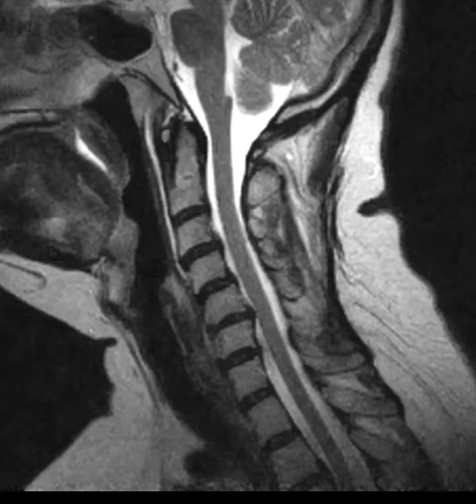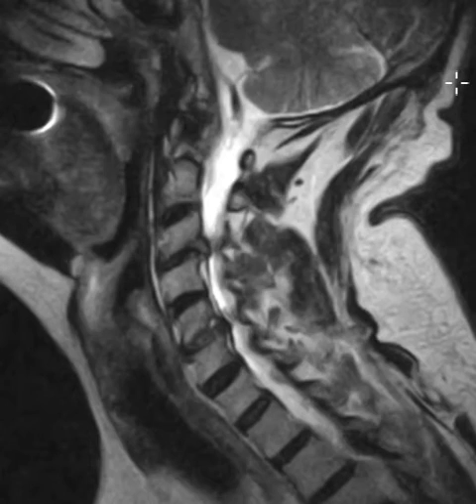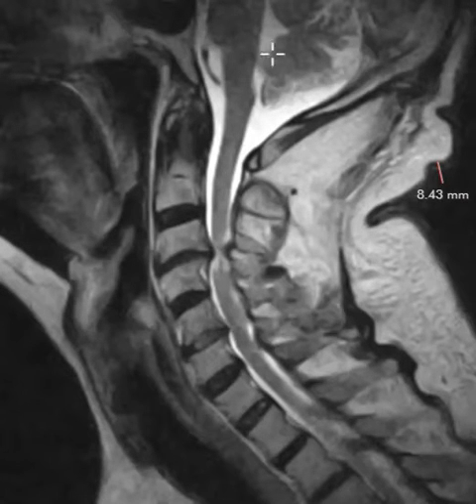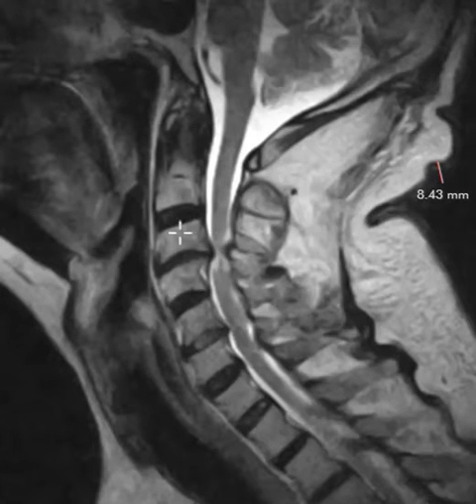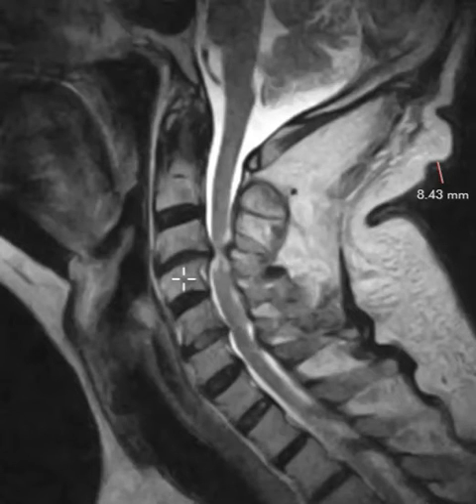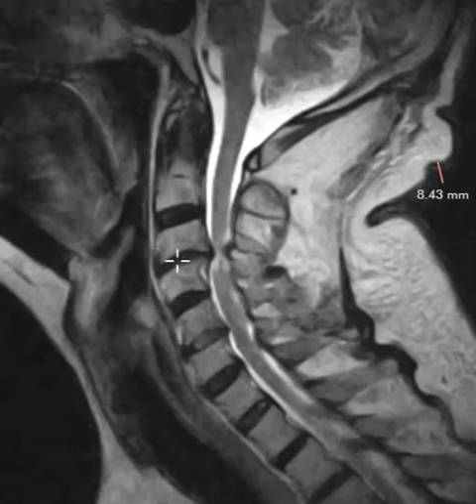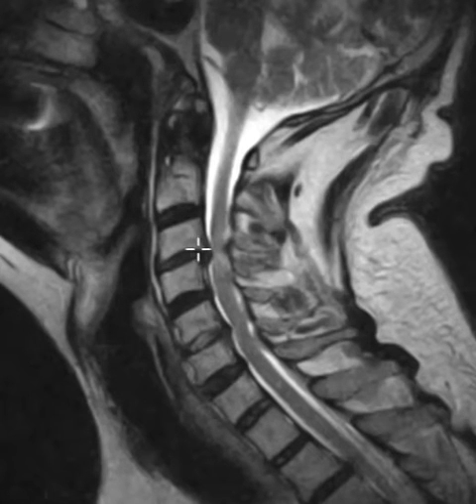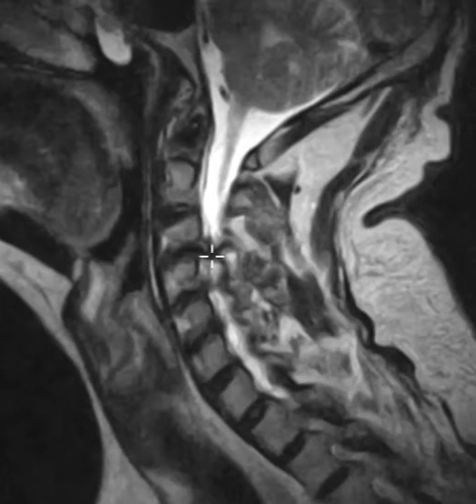So now we're going to go to the abnormal spinal cord. This is another patient, and they have the spinal cord coming down — here it looks fine, but we get to this level. This is the C3 vertebral body, this is the C4 vertebral body, we have the disc in between — the horizontal black area here is the disc space. We have a disc bulge or protrusion here. If we roll off to the sides, we have some bony spurs that are pretty prominent.